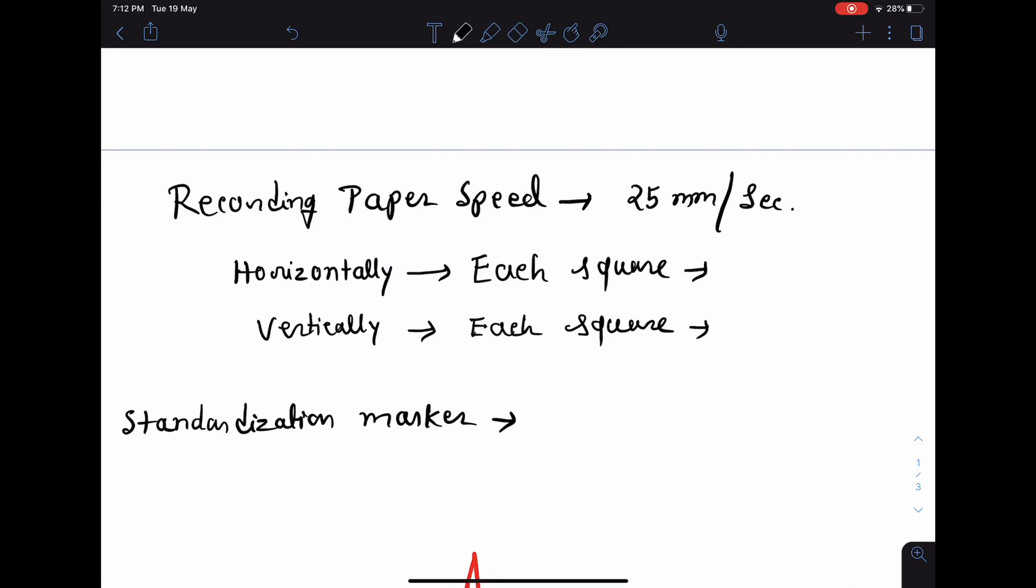Now whenever an ECG is recorded, almost universally the speed of the recording paper is kept at 25 mm per second. So if the paper moves at a speed of 25 mm per second, then each small square horizontally will represent 0.04 second, and vertically each small square will represent an amplitude of 0.1 millivolt. In the horizontal plane it represents duration, and vertically it represents amplitude.